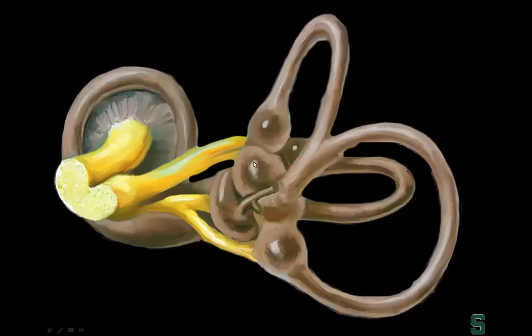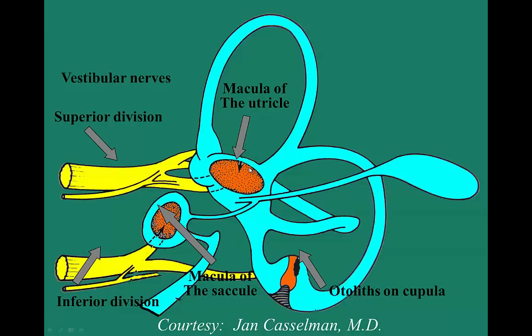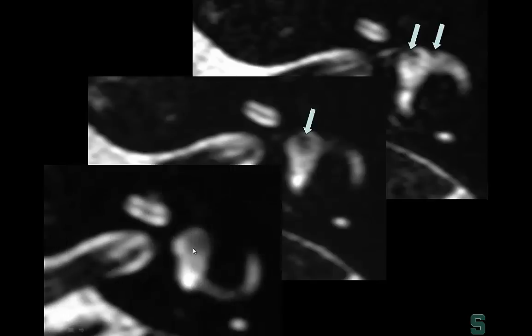We can now see the macula of the utricle. When we talk about balance, the otoliths are located in the saccule and utricle. On heavily T2-weighted images, you can see a small area of increased signal within the vestibule in three planes. We've described the normal morphology — one to two millimeter thicknesses involving the macula of the utricle.